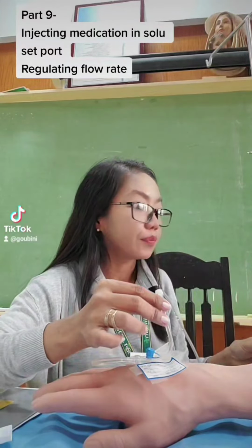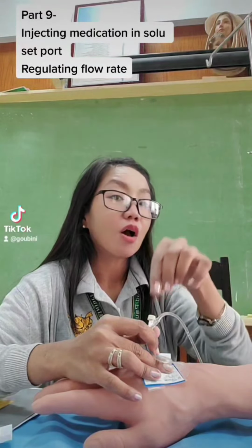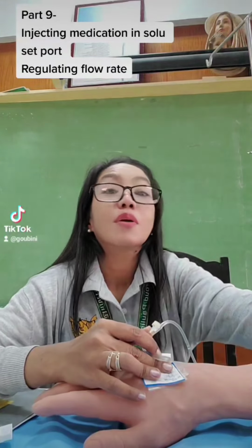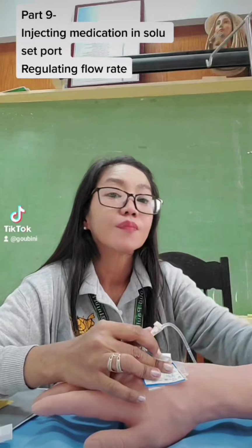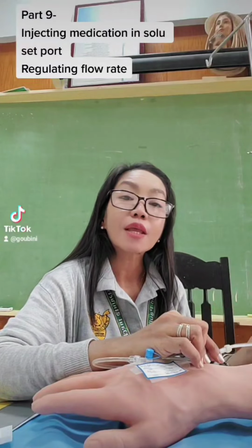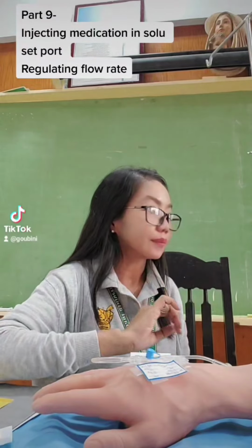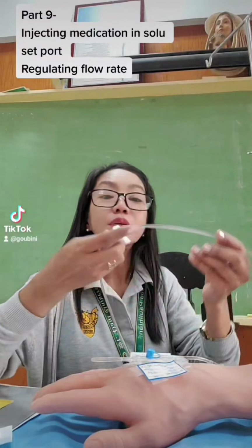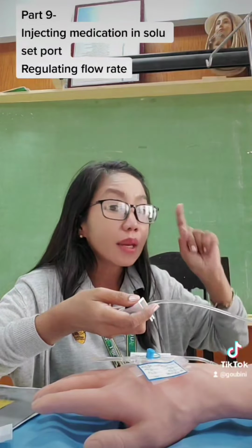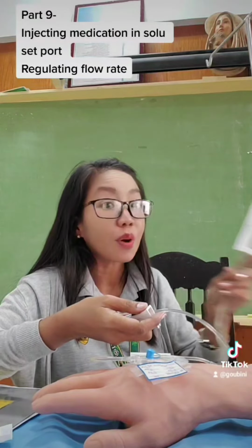Assuming that this is the main line, using a needle we will inject it in this part. So again, you will disinfect this port first. You connect your soluset, and after that you will open the regulator. Calculate the drops per minute, meaning in 1 minute there should be 100 drops per minute in the needle.